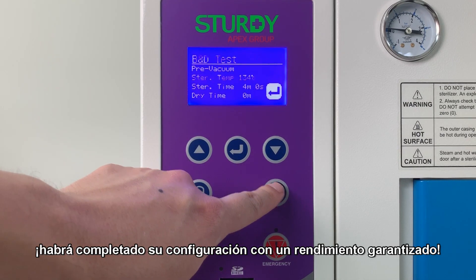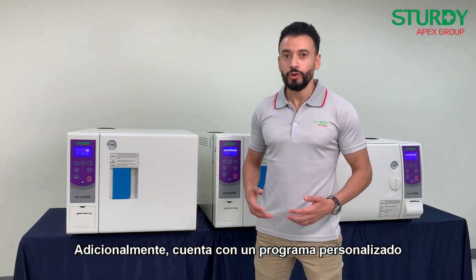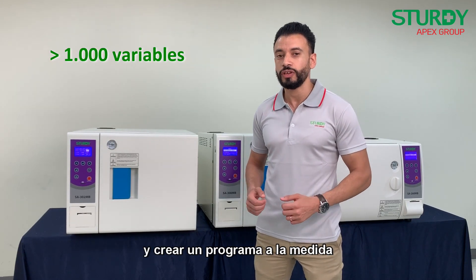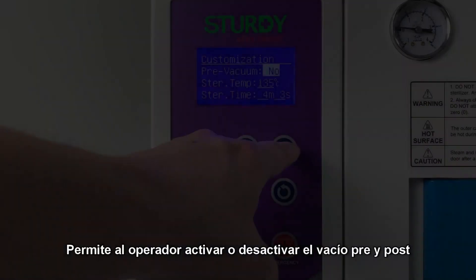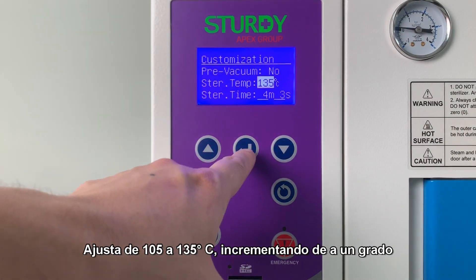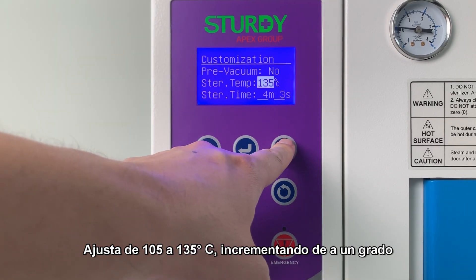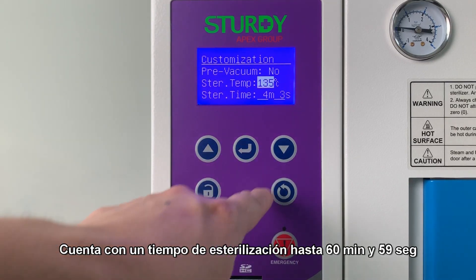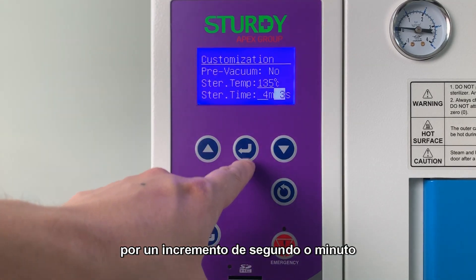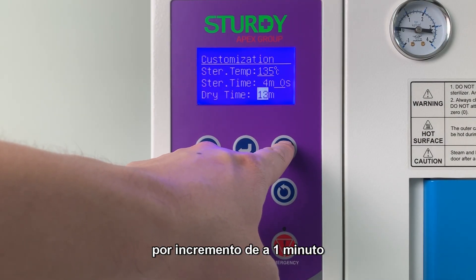All programs are hassle-free and pre-programmed with just a few simple clicks. We also have a customization program enabling users to choose from more than 1000 variables and create a tailor-made program. This allows an operator to switch pre and post vacuum on or off, adjust temperature from 105 to 135°C by one-degree increments, set sterilization time up to 60 minutes and 59 seconds, and adjust dry time up to 60 minutes by one-minute increments.